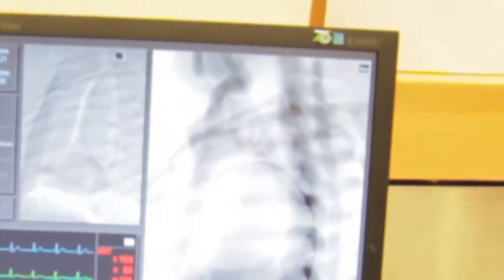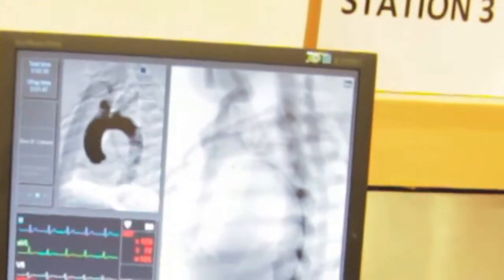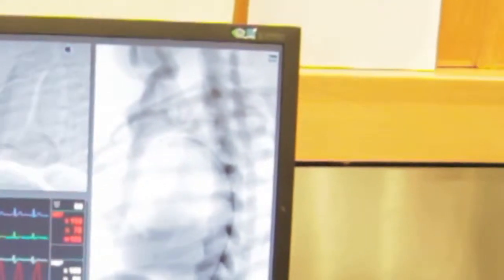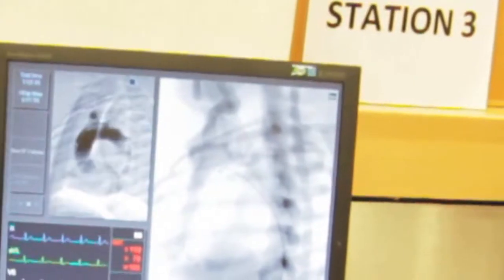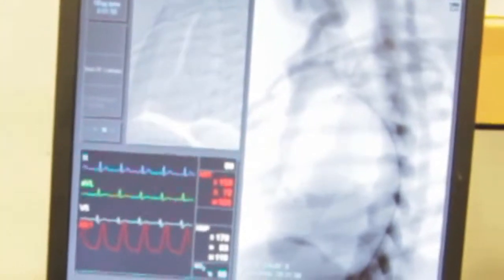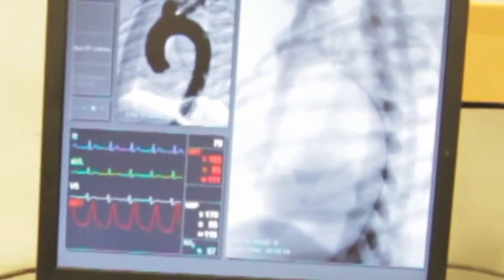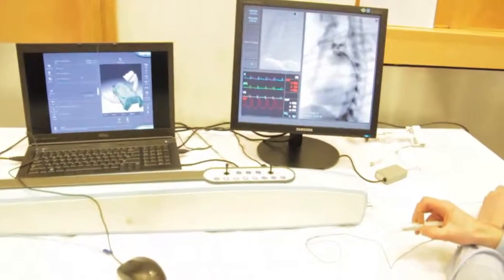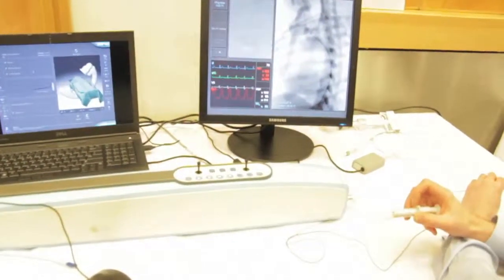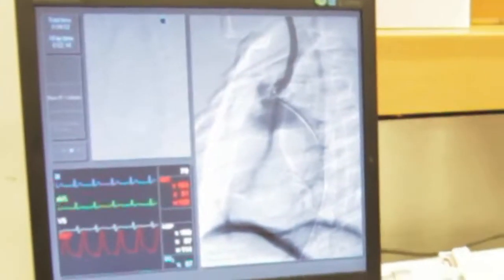We have contrast ready and select the vessel by withdrawing the catheter while rotating at the same time. We want to try and avoid the innominate artery, which is at about this point. The catheter is just starting to fall into it there — there's a little flick of movement — so we'll use the catheter in this shape and it will just jump. As we come close to the left common carotid, we torque the catheter and it should fall into the vessel. We can confirm that by injecting a little bit of contrast, or do a subtracted hand injection, which demonstrates that we've selected the left common carotid artery.